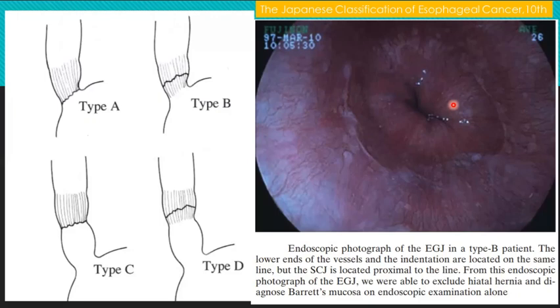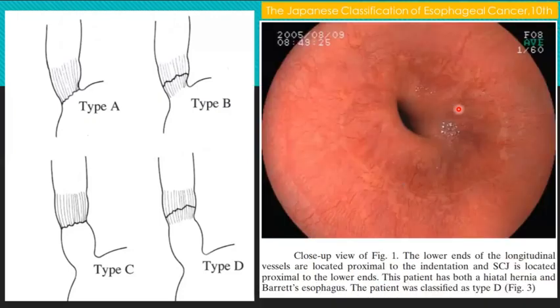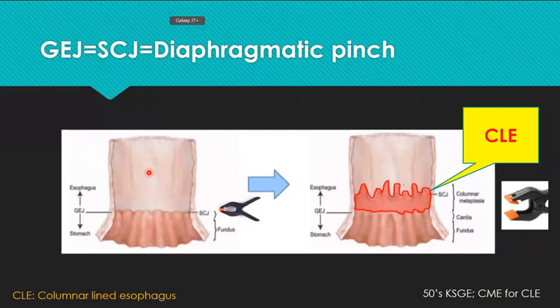But this is not only the Japanese style. Let me check out other countries too. Before this, I'm going to introduce the American style again, or Western style, or traditional style. Think about it, there are only 2 components, esophagus and stomach. It's very delineated because the pinch-cock is holding that area very well.